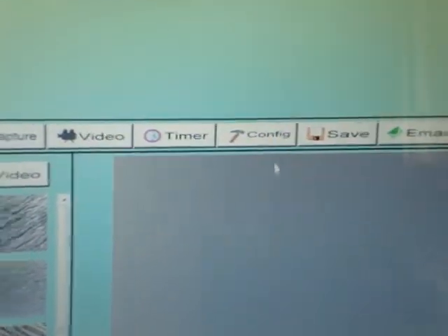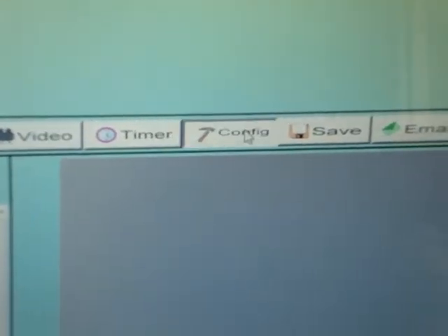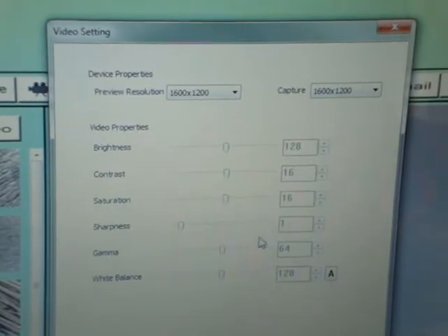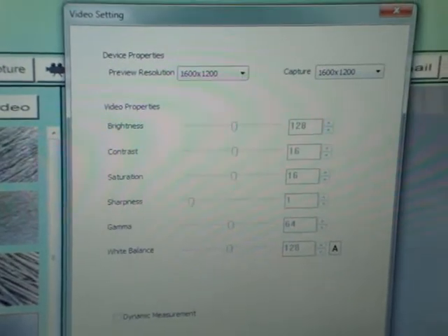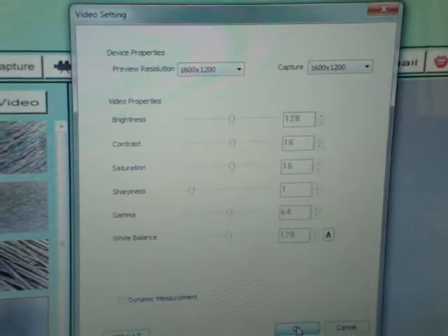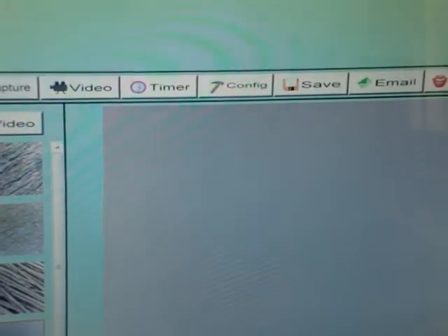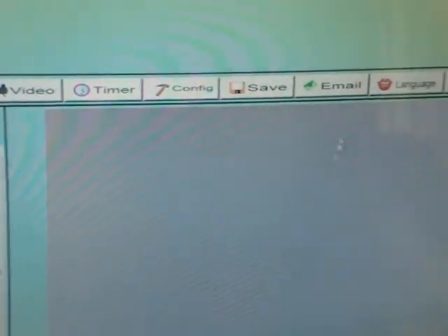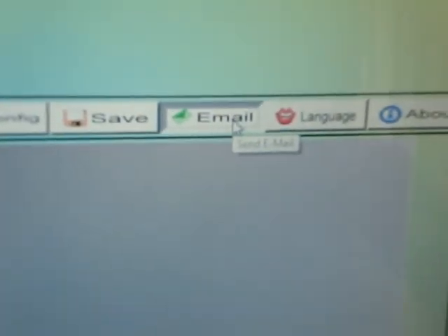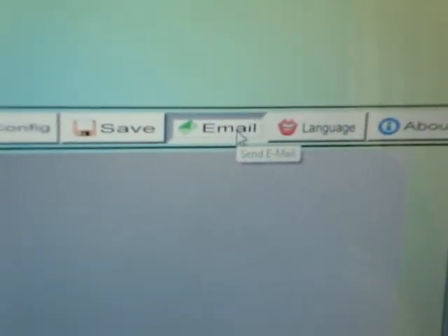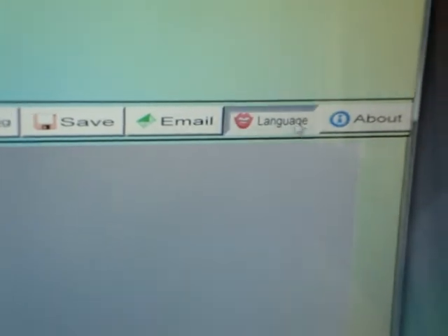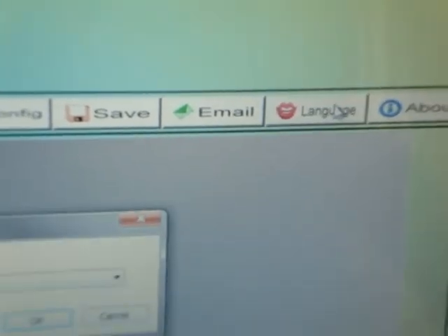Configuration settings can be adjusted to suit your requirements. Email icon can be used if one requires to directly mail the image taken. Fourteen language options are there for you to choose from.